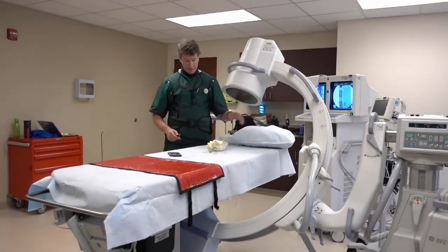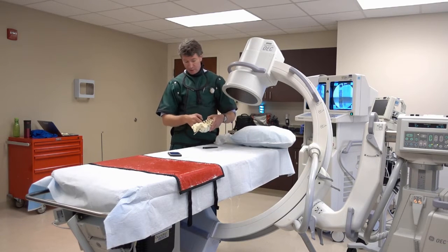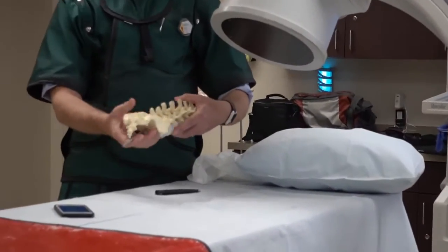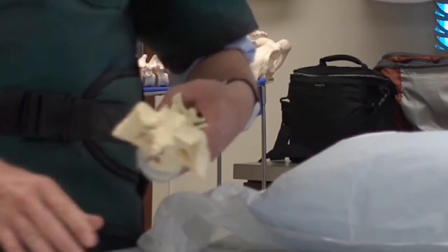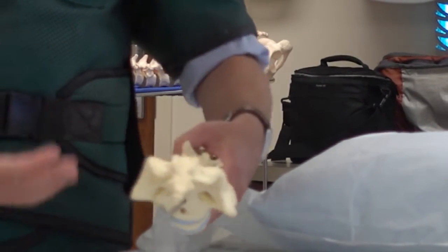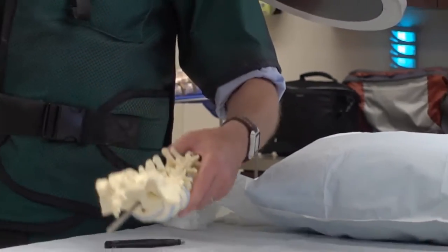The reason is because I want that back to be as flat as possible. If the back is flat, you can see these what we call interlaminar spaces open up the most. And if they're lying as they would normally, you can see that they're closed. I want as much access as possible, so I'll often ask Michelle to put 1, 2, or maybe 3 pillows under their belly, or just right under their belly button, to flatten out what we call the thoracolumbar junction so we can get the needle in easily.